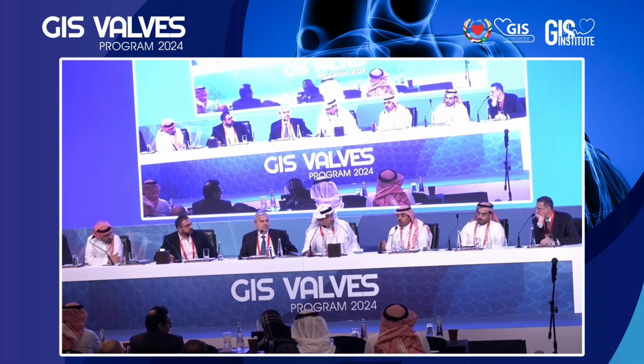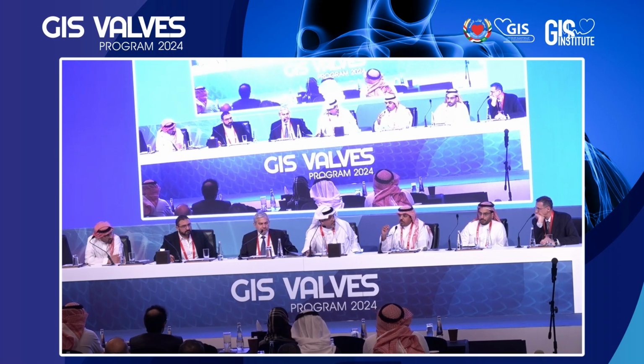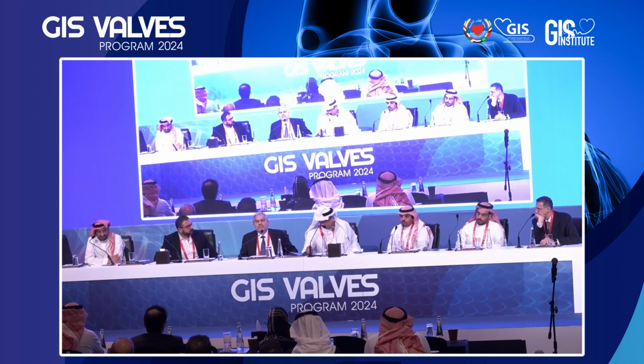But if you're in doubt and you use a self-expanding valve, as long as you're not in a gray zone between using a smaller valve versus a bigger valve, if you're confident about your sizing, then a self-expandable will basically grow until the right point. If you use balloon expandable and you're worried that you might overinflate, you could take 1 cc out and then post-dilate if you need to. But I don't do balloon sizing at all.